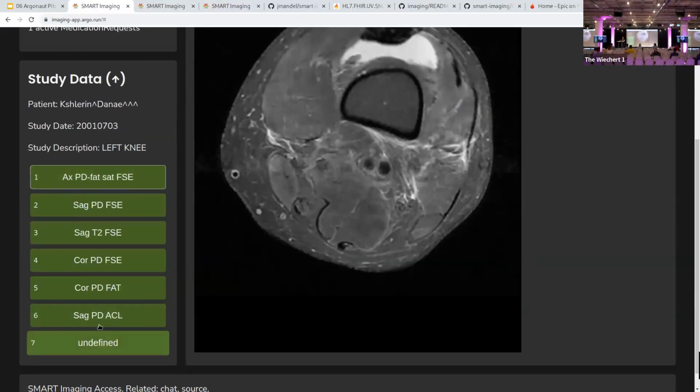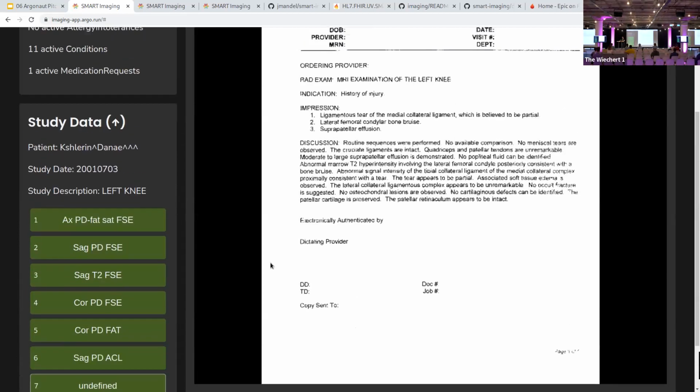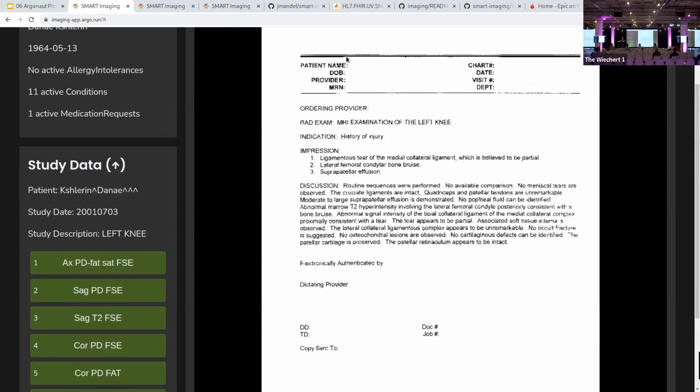I mentioned that sometimes there are notes just stashed away alongside the images. So this was an example of what that might look like in a DICOM viewer. And this is anonymized data, so you see redacted information here. Some of this has been whited out. All right, I want to talk about the spec and some of the reference implementations.